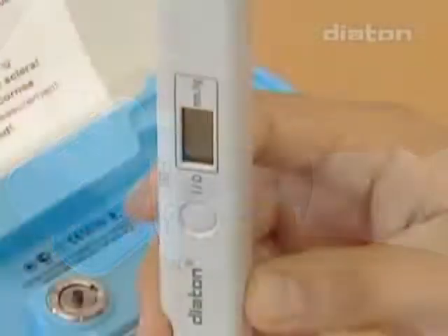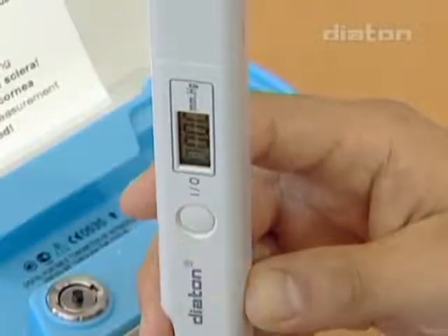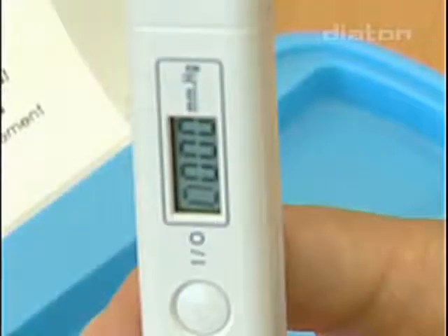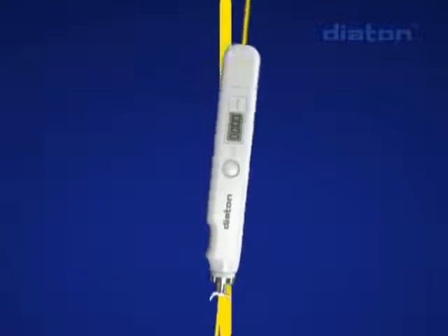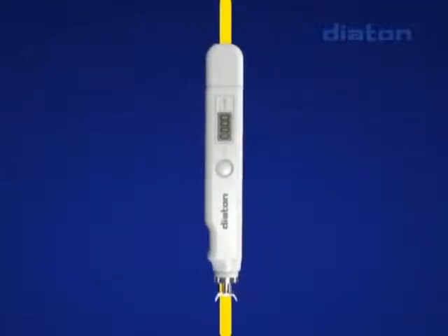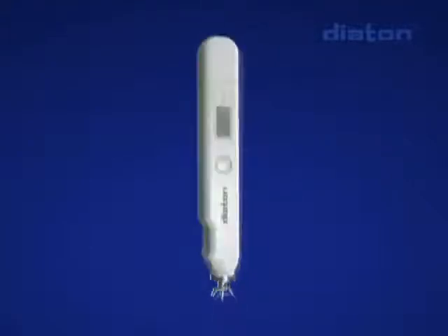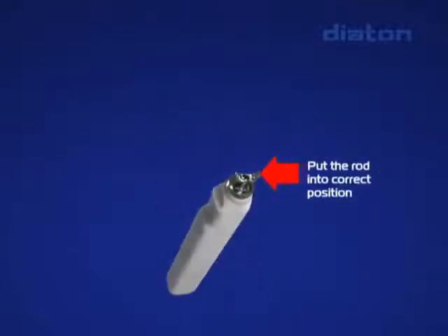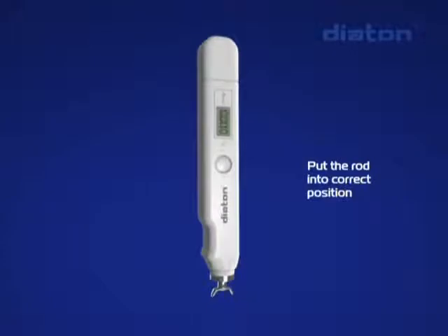Press the operation button briefly. The symbol of four zeros appears on the display and a short sound signal is heard — the tonometer is ready for work. If the tonometer is held with its tip downwards but not strictly vertically, a pulsing sound signal from the position indicator is heard. Measurements can only be made in the vertical position when the pulsing signal is absent. If you turn on the tonometer when the rod is not fixed inside the body, the four-zero symbol pulses on the display — put the rod into the correct position.